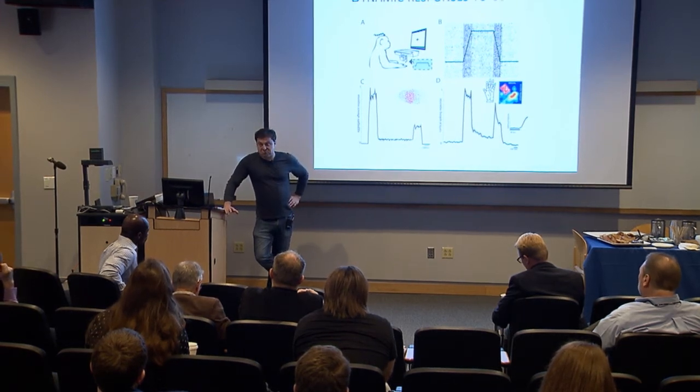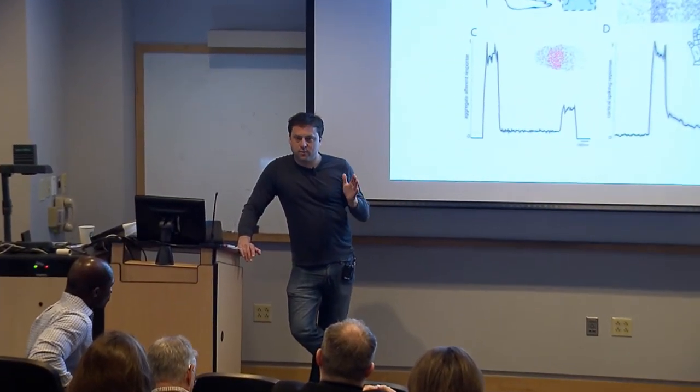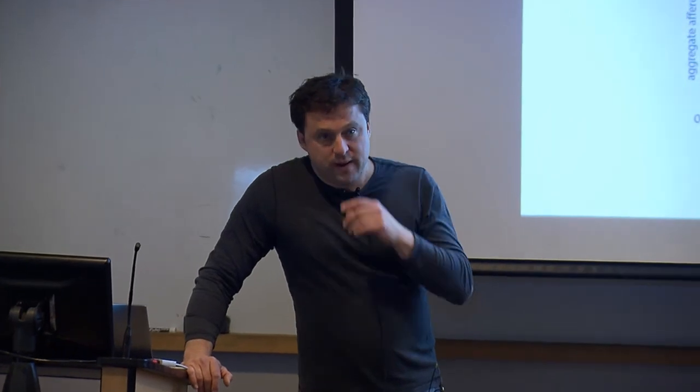And so we looked at these electrodes, because you would expect a posterior to anterior gradient in threshold or something, and we found nothing, right? So there might be an effect. If there is an effect, it's a weak one. Others have looked at this, and there is a gradient. I think you get more sensitive as you go deeper. Like I think Kevin Otto did that. But these effects are pretty minimal. It's not like your threshold's double or half. So we didn't see anything like that.